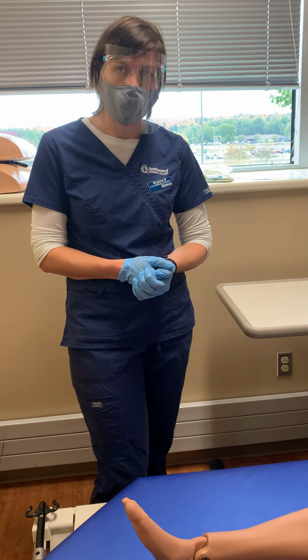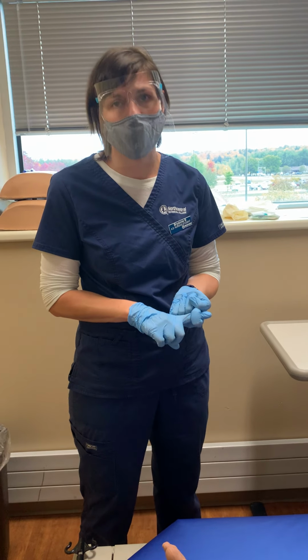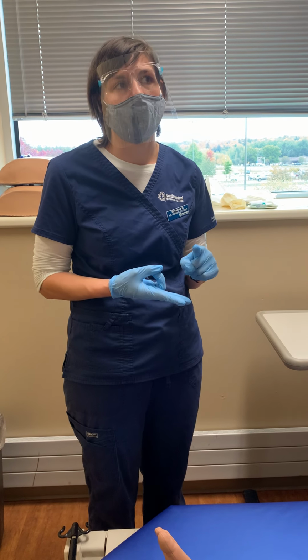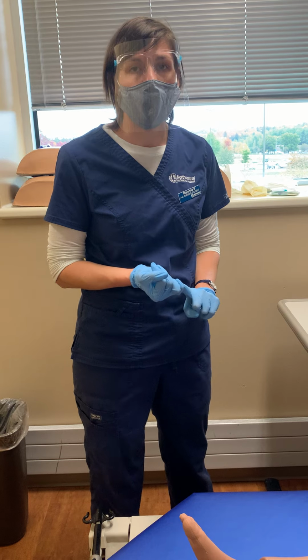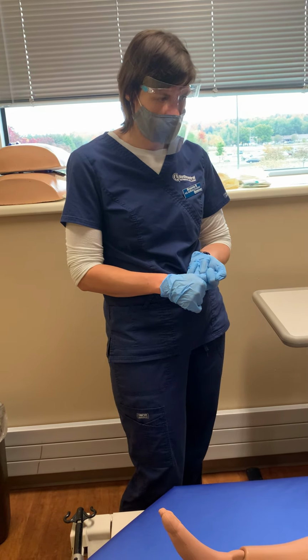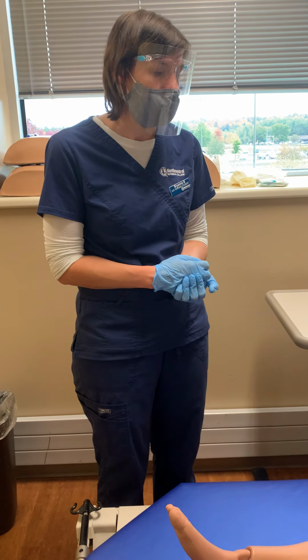I would document, upon leaving the room, the IV piggyback potassium, and I would document that it is secondary, the rate administered when I started it, and how it was tolerated. I would also document the morphine that I administered, the 2 milligrams, which was 0.2 mL. I would chart that I administered it in the second lumen, which was available in the PICC. I would document how it was tolerated. I would come back in about half an hour and assess her for pain and see that it was in fact helping with that 9 out of 10 pain.